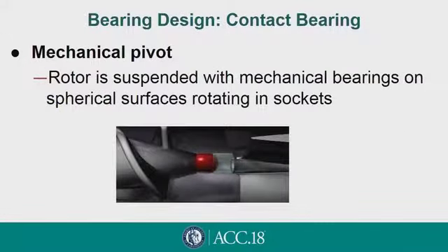Now, the impeller or center device in a continuous flow rotary pump is suspended in a variety of mechanisms. In the simplest design, it's a mechanical pivot design where there's actual mechanical suspension of the impeller, where the impeller is connected to a stator or a mechanism that uses a ball and cup kind of design. Now, this design is simplistic, but has a number of limitations.